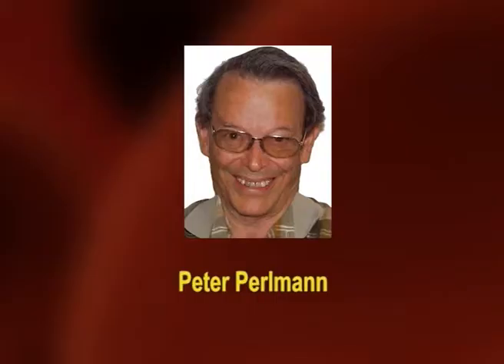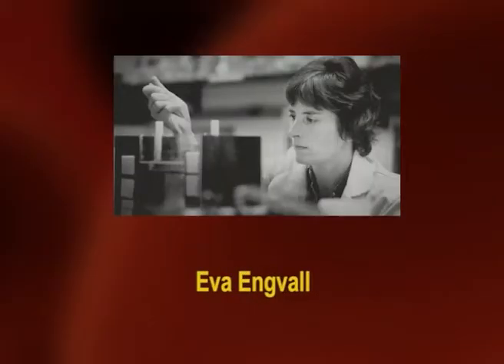ELISA is an antigen-antibody reaction based assay. In 1971, ELISA was introduced by Peter Perlmann and Eva Engvall at Stockholm University in Sweden. It is a common laboratory technique which is usually used to measure the concentration of antibodies or antigens in blood.